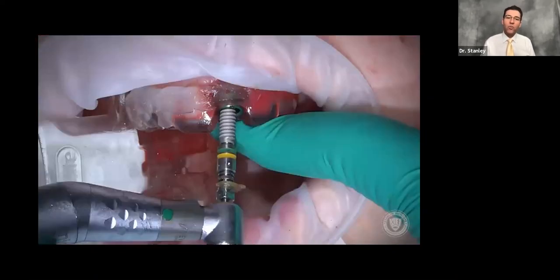Now that the hole is drilled, we pick up our implant on our driver — the part with the yellow and green on it. Right above the motor you'll see a snap link that can go into one of four positions. In this case, it's in stop position four, determined mathematically by the laboratory. When the case comes in, you open the case report and it says to put the snap link on stop position four. That means when I carry this to the mouth, I drive this implant until that snap link touches the top of the surgical guide — once it touches, I know my implant is at the proper depth.